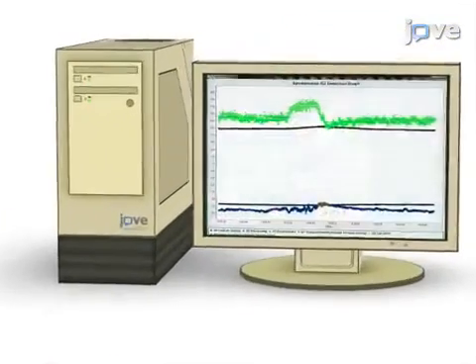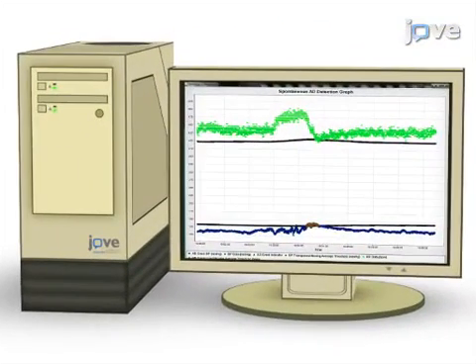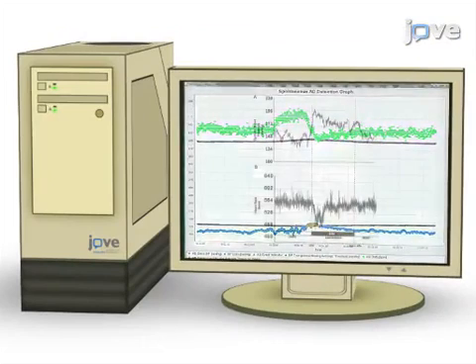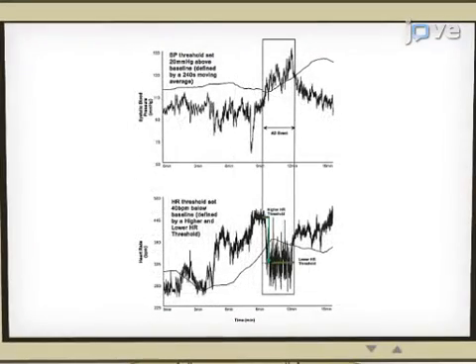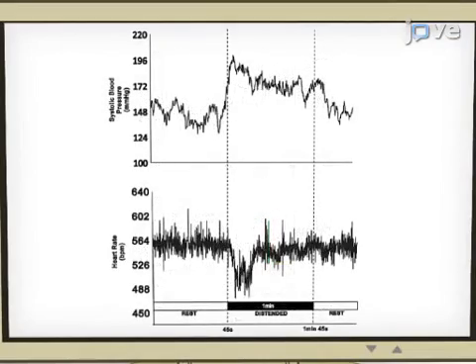Next, AD detection software is used to detect and characterize the spontaneous AD episodes. Alternatively, AD can be induced non-invasively with a Foley catheter, followed by real-time monitoring of the induced AD episodes. Ultimately, the episodic hypertension and onset of bradycardia that occurs as a result of the spontaneous or induced AD incidents can be evaluated by the AD detection software.